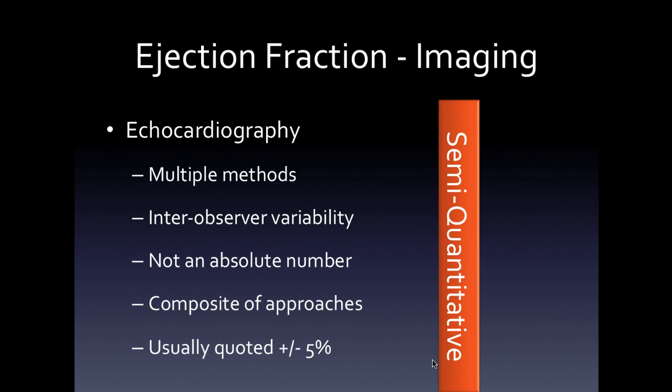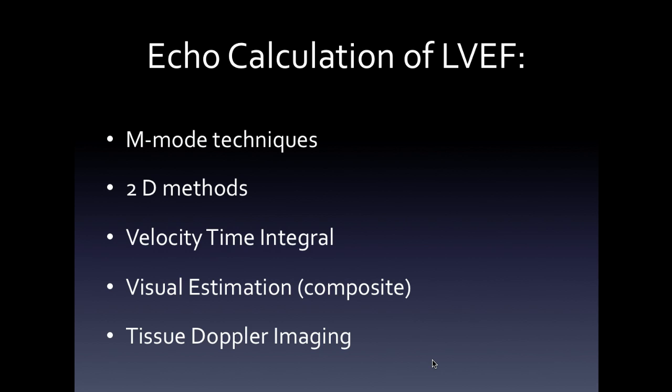So these are the issues, these are the calculations. I know that there's a previous lecture that Roisin sent on, which I looked through, and some of this has been covered, so I'm not going to reinvent the wheel, but we'll just pop through this in a clinical setting.